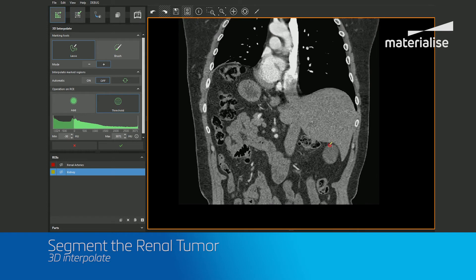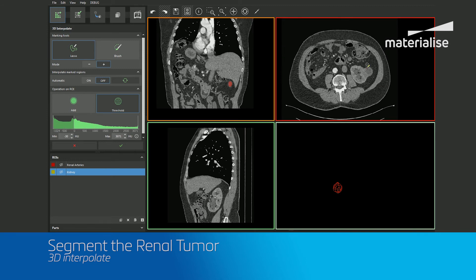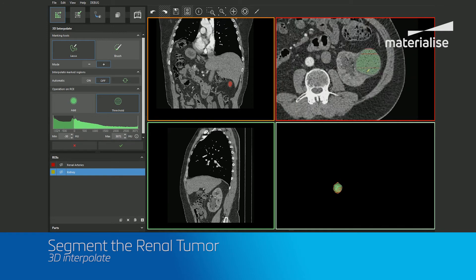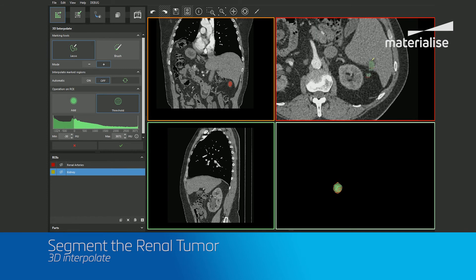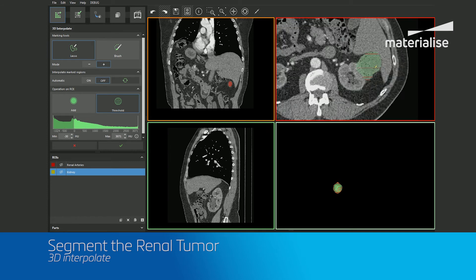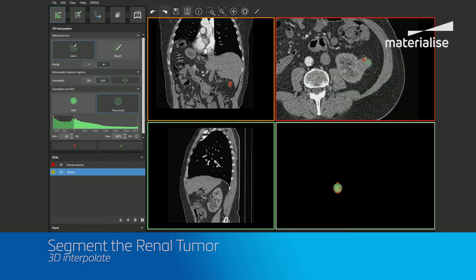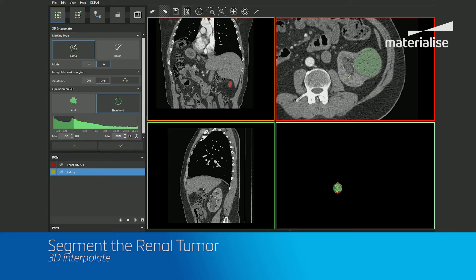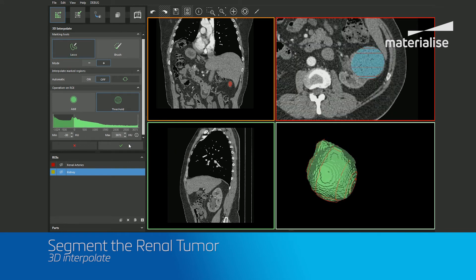You'll notice I'm skipping every couple of slices since we will be interpolating between them to help save time on our segmentation. You can also make your markings on any plane that you wish. But once your markings are complete, click on the interpolate button and choose your threshold range, making adjustments to your markings at any point if necessary. If you do need to make any adjustments, just be sure to re-click the interpolate button afterwards to apply the changes.